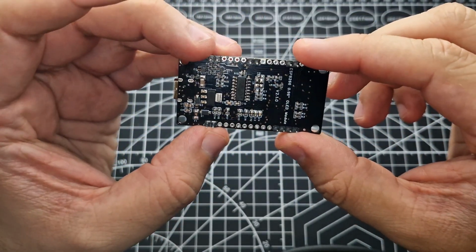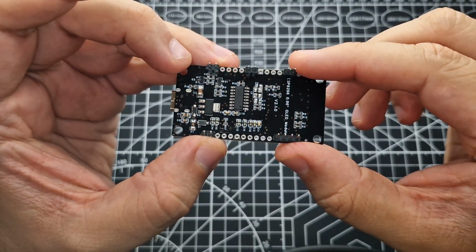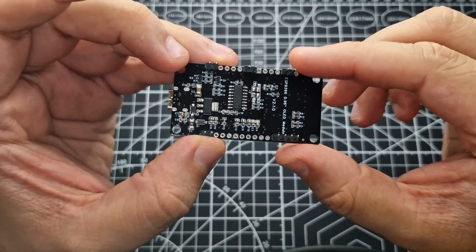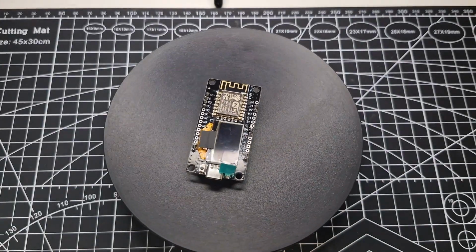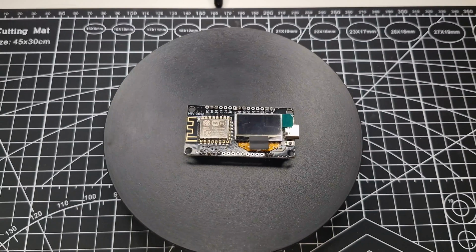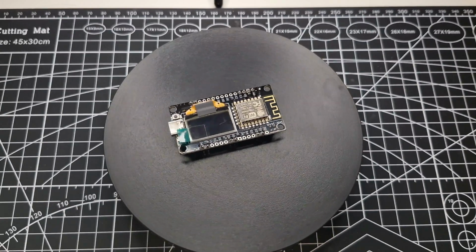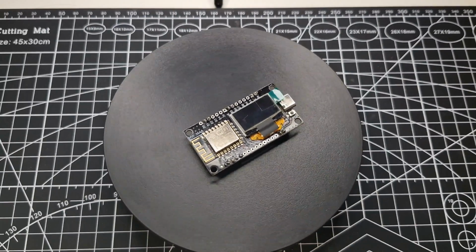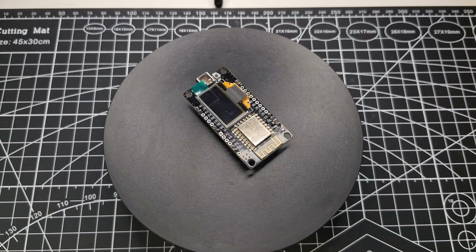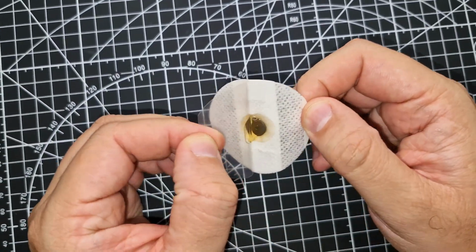We will use an ESP8266 NodeMCU. This circuit board integrates the NodeMCU and a 0.96 inch OLED display, providing all the functions of traditional ESP8266 modules with the same size and peripheral ports, as well as higher performance development tools and high definition data visualization. It comes with 3 self-adhesive electrodes.